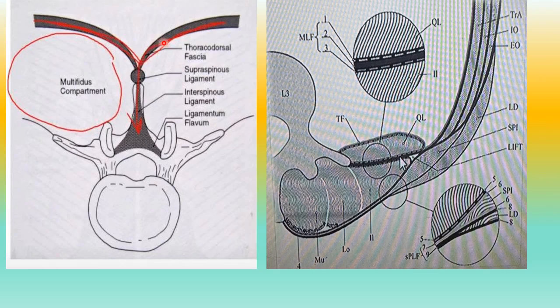So it is a very tough structure and it hampers your movement of instruments, and the egress of fluid is also hampered by this fascia because it is a very tough structure. So you have to divide this fascia as explained in later slides.